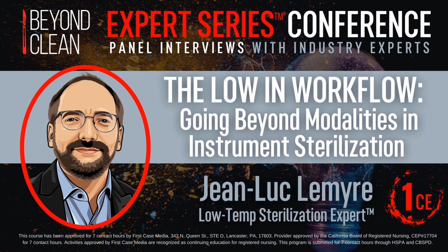Oh, interesting question. That's a new one to me. Our system doesn't have a cassette and would never be ejected mid-cycle. So maybe if that happened and there's still sterilant in it, that's got to be handled like a dangerous material for sure. So hopefully the facility has policy in place and the right resources to deal with a hazardous material. It should not be disposed of in regular trash for sure.